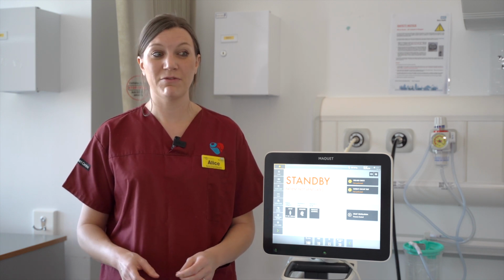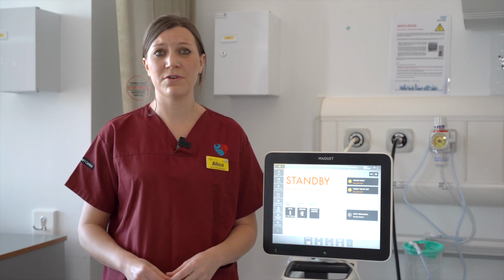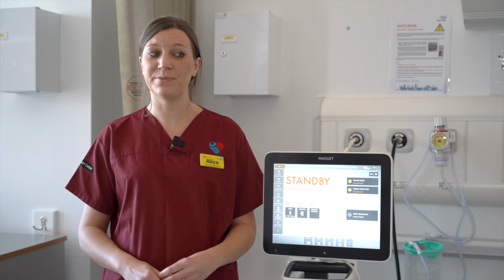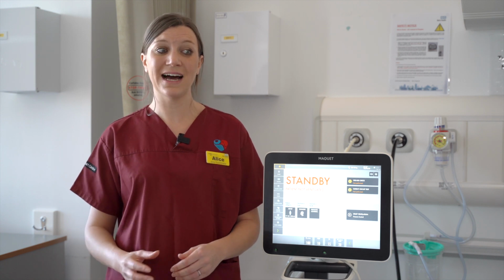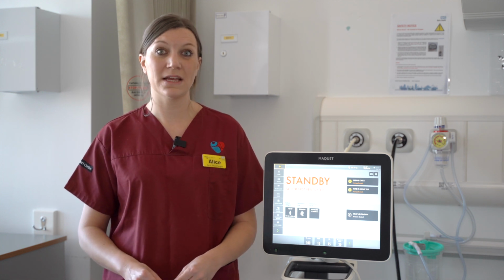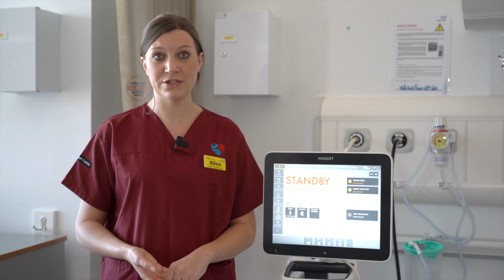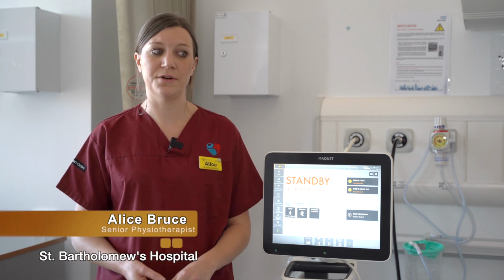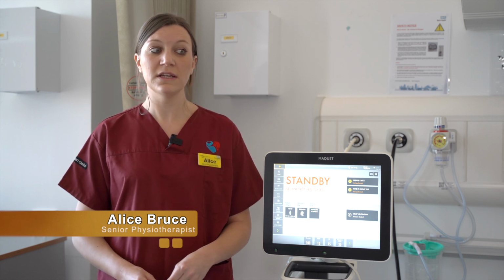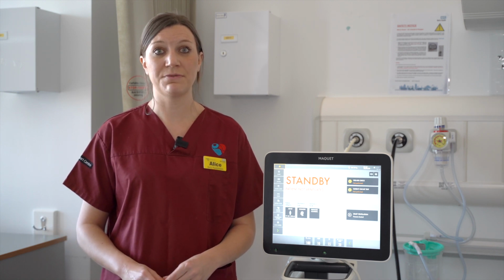First of all, think about looking from the end of the bed. Think about the airway that the patient has, whether that's a tracheostomy or an endotracheal tube. Assess their work of breathing and their chest wall movement, also taking note of their colour and how they look from the end of the bed. Take from the monitor the basic respiratory markers, such as your oxygen saturations, your respiratory rate, and your end tidal carbon dioxide. On approaching the patient, it's important to feel the chest wall, feel for the movement, and see if you've got equal expansion left and right.